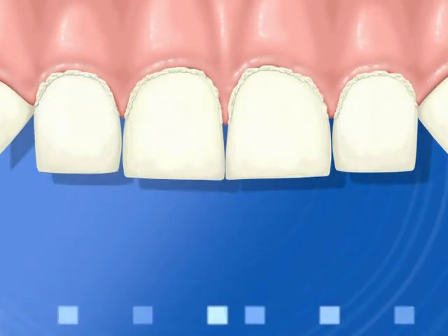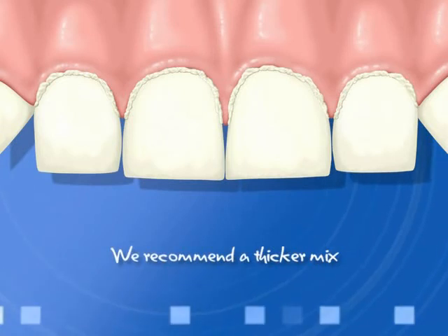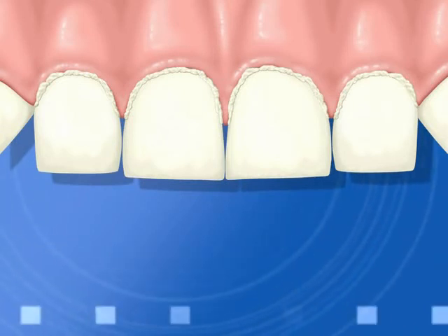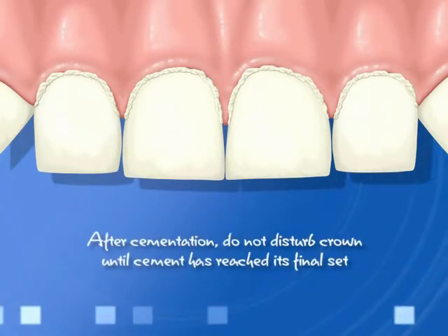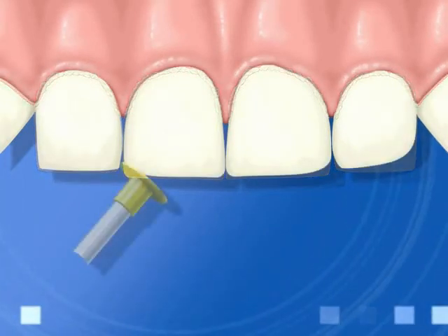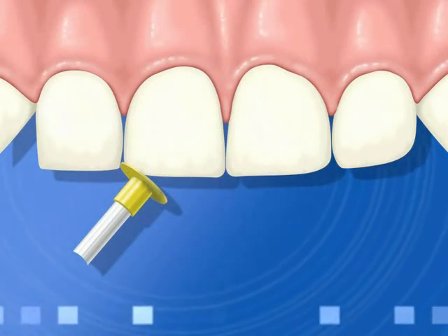If you are using a liquid powder glass ionomer, we recommend a thicker mix which is stronger and will also keep the crowns from slipping down while seating multiple unit cases. After cementation, do not disturb the crown until the cement has reached its final set. Clean up the excess cement following the manufacturer's recommendations.